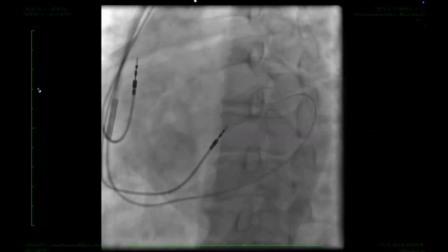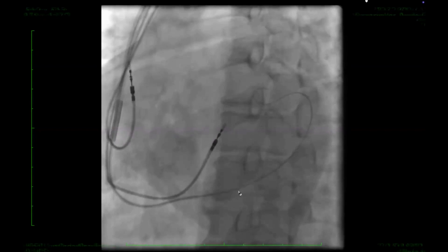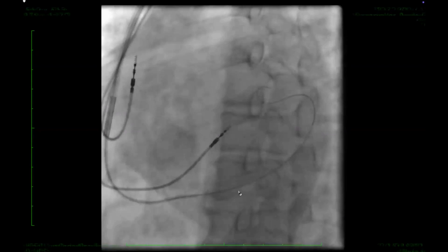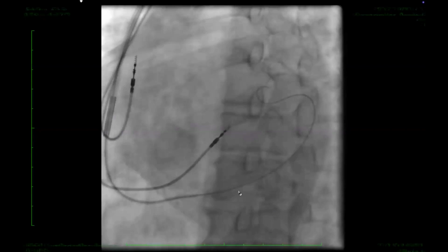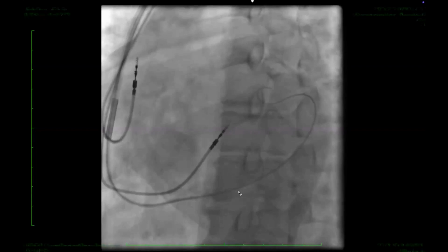So I don't know whether you use Amplatz. It's an Amplatz. Is that what you use routinely? But it's hooked in. Go ahead. I imagine, it looks like the right atrium is enlarged so that the reach. Very big, absolutely. So it's a very big right atrium.